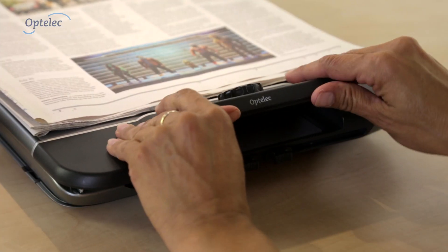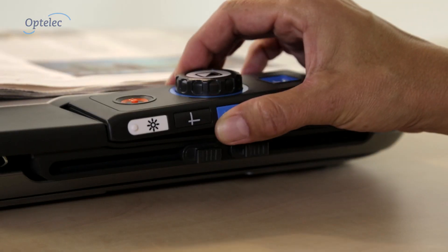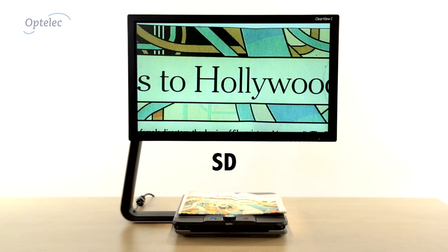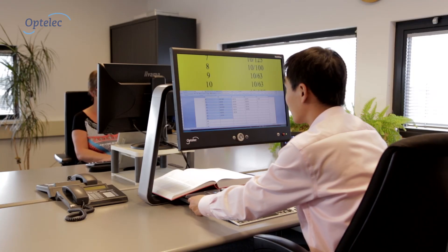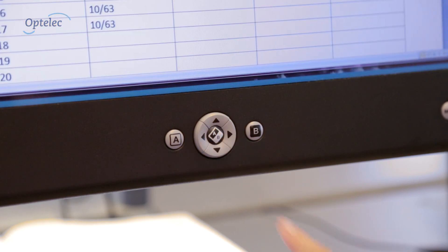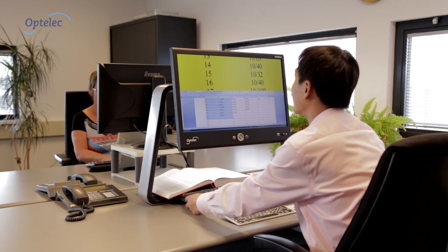The product's customizable setup enables you to choose the model that suits your needs. Choose a larger screen to see more or a high-definition camera for lower magnification and sharper vivid image. And when you are at work you can display the Clearview C image and the computer image on one monitor with the optional TwinView monitor.